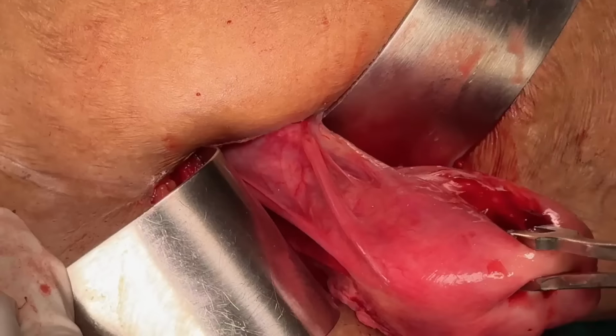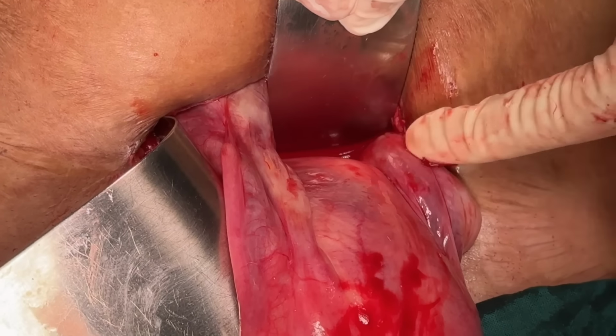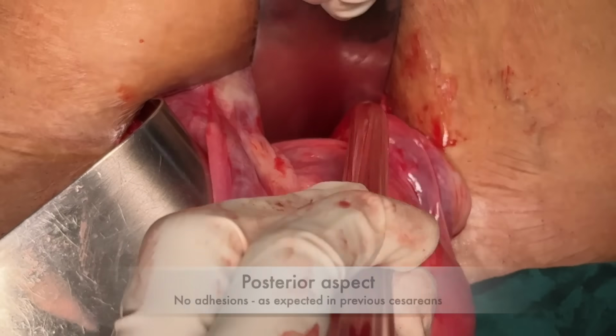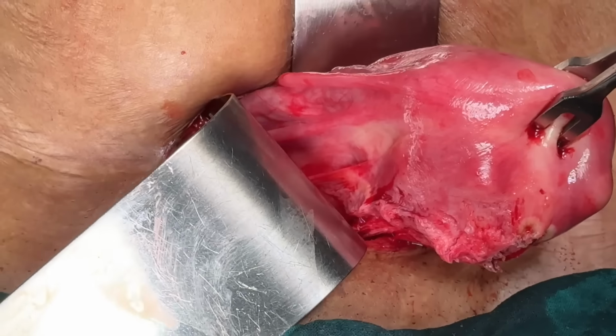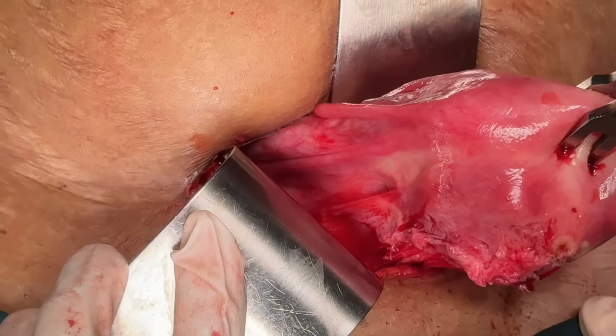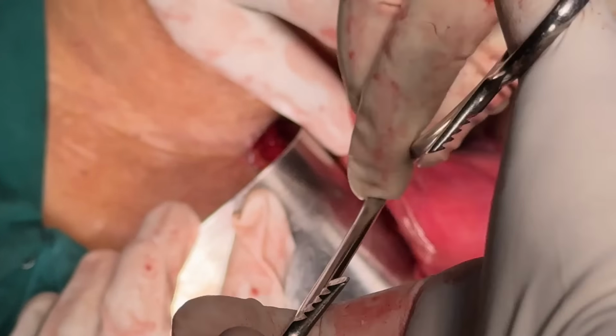Moving on to the posterior aspect, there are no adhesions on the posterior surface and you can see the lower limit of the cervix here. In cases of previous cesarean, there are usually only anterior adhesions. Now let's start the hysterectomy.